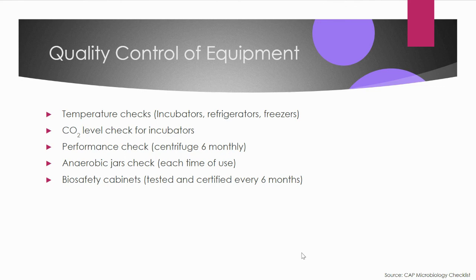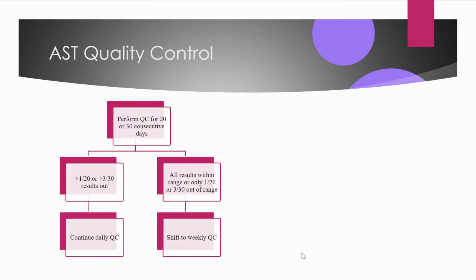AST quality control in most labs is run weekly, but before switching to weekly QC, you must first perform QC for 20 or 30 consecutive days. If more than one out of 20 or more than three out of 30 results are out of range, continue daily QC — it indicates a problem with media, the ATCC isolate, or the AST system. Find the root cause and remove it. If results are within range or only one out of 20 or three out of 30 are out, the QC is acceptable and you can shift to weekly QC.